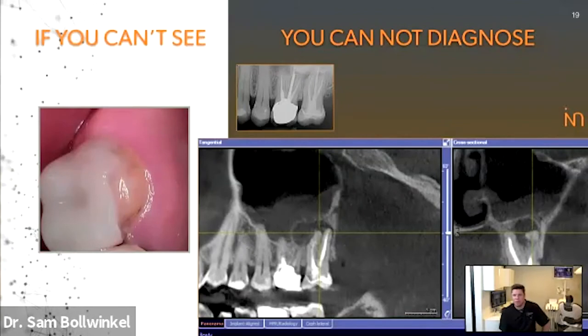Dr. Timothy, what else would you call that? No, that's correct. And with the lesion there, you would put down in your report, which can be as simple as, the CBCT was reviewed, but in your notes, you need to say that you saw an odontogenic sinusitis. So this is of odontogenic source, right? And you have that periosteal reaction that pushes the floor of the sinus up, like you explained. And so you've raised that floor of the sinus up there from this lesion that's growing around the apex of 15.